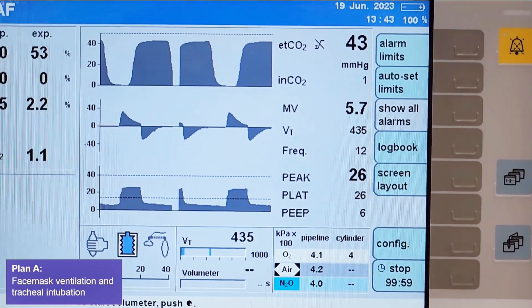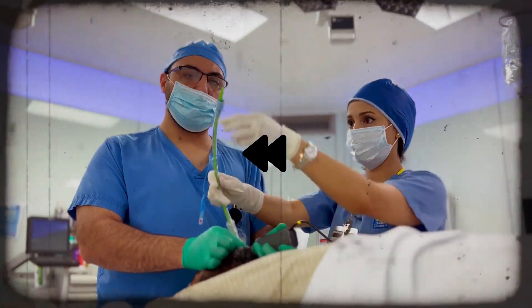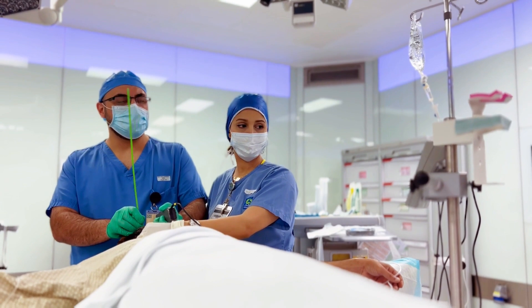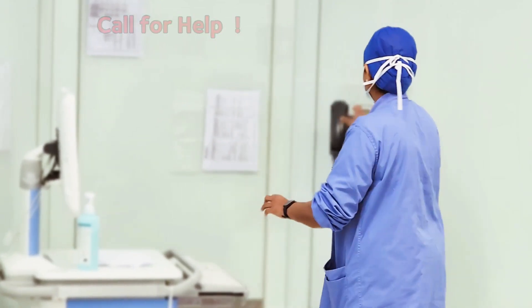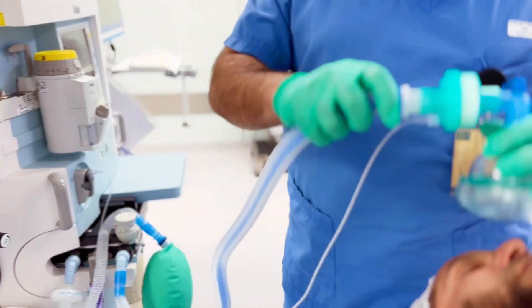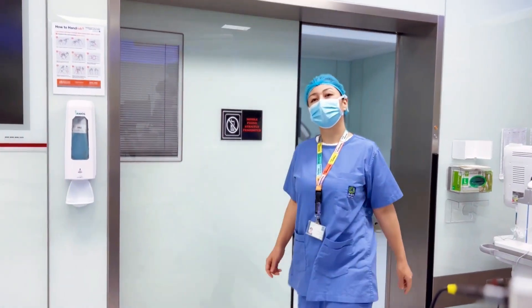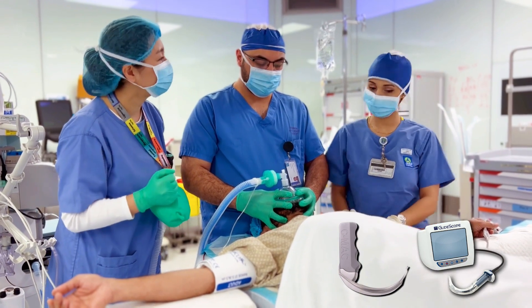Confirm tracheal intubation with capnography. That was a successful attempt. But what if it didn't work out? If that attempt is unsuccessful, seek assistance — please call for help. Remove cricoid pressure. Maintain oxygenation as you wait for assistance. A hyperangulated blade, such as a D-blade or GlideScope, should be used during video laryngoscopy by the senior anesthetist.